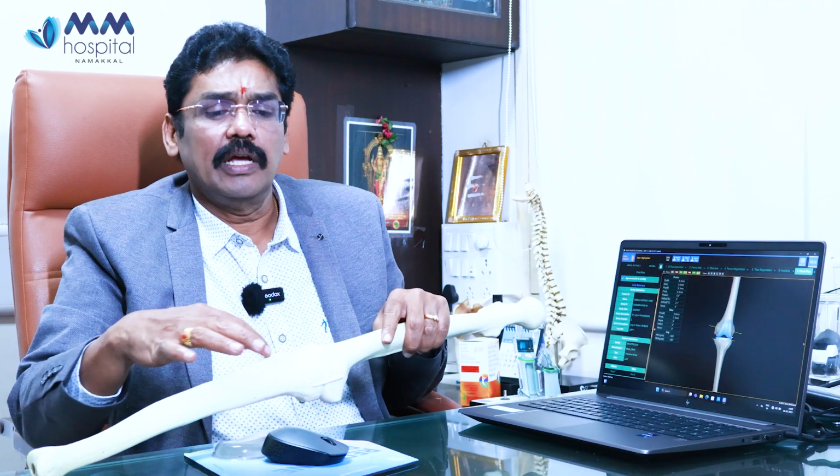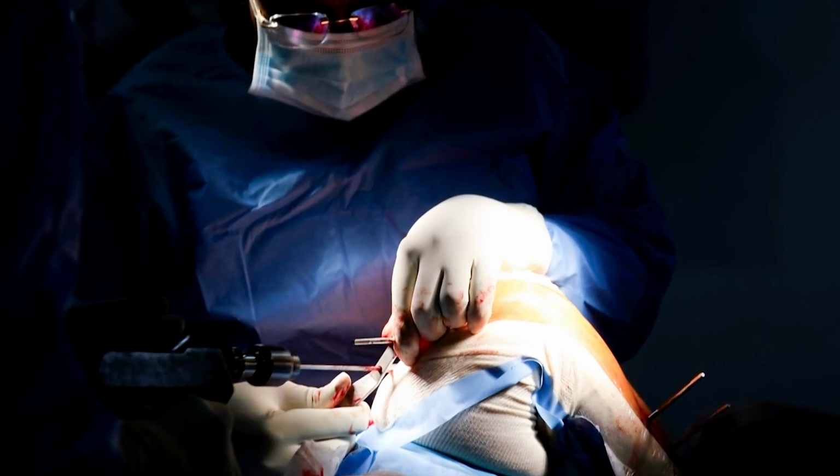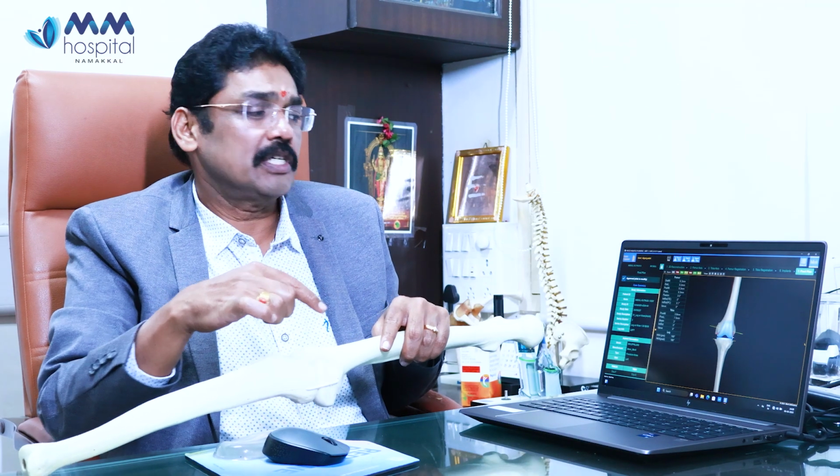This is the plan. With this plan, I take the patient to the theatre, open the knee joint and mark all the points of the bones around the knee joint which have been registered in the software before the surgery. After marking, I do the gap check.